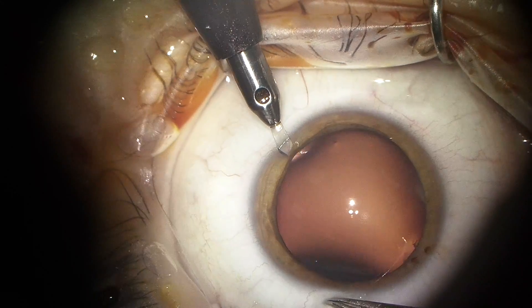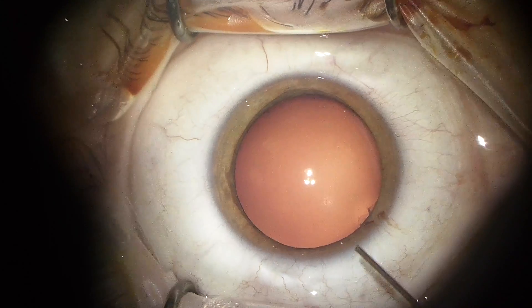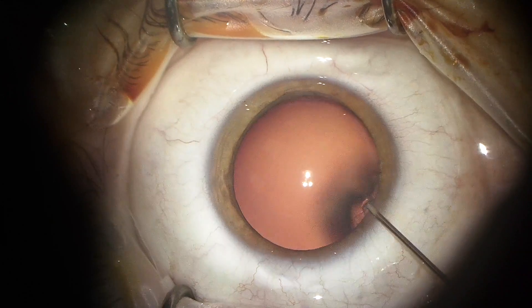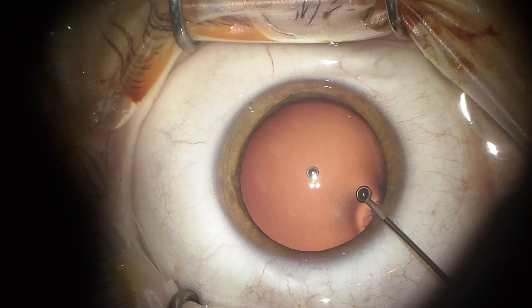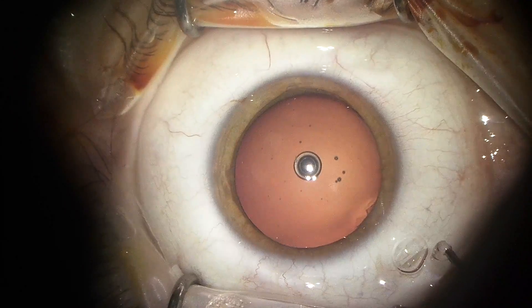This Visian ICL is an implantable contact lens that's an alternative to LASIK or PRK, which are two other refractive procedures. A refractive procedure is one that's used to reduce someone's dependence on glasses.